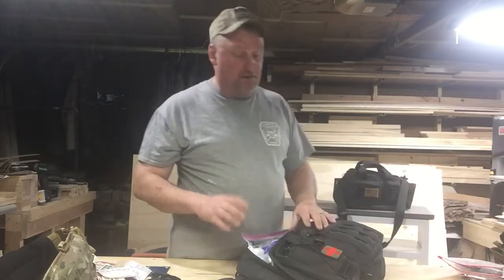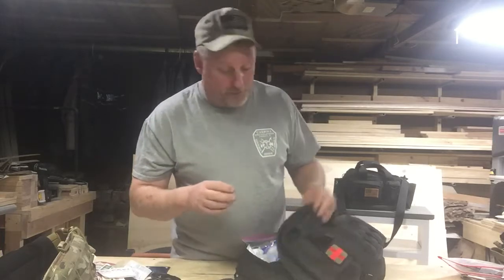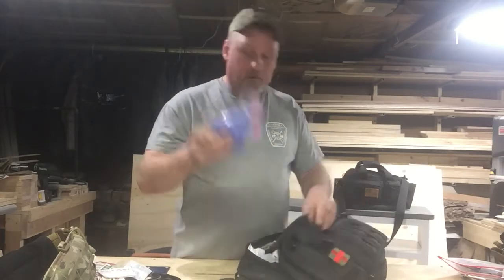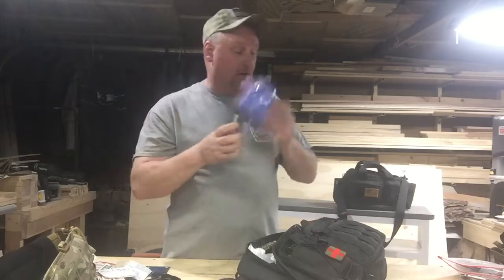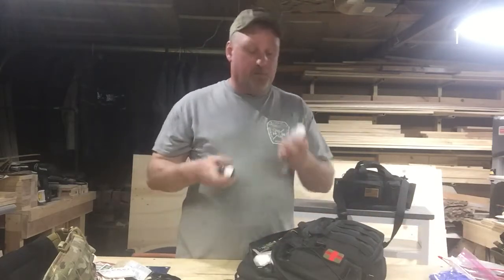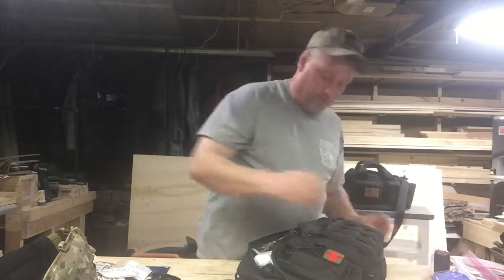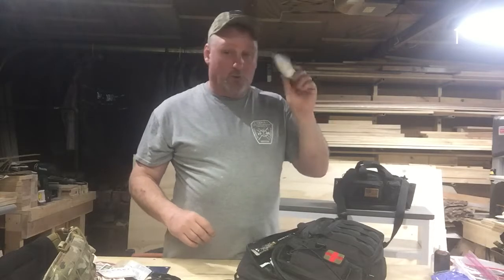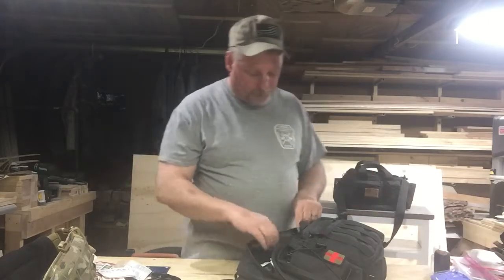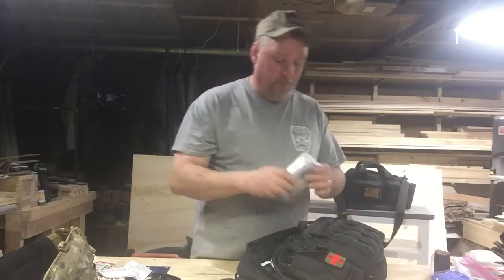Again, if you're using a kit this size, you're probably going to be out in the field longer. You're going to have to handle these things a little bit longer. Larger pack of gloves. So now I can carry more stuff because I've got a larger kit. Larger bottles of iodine and alcohol for antiseptic. More cotton balls. Chem lights, to be able to see what you're doing.